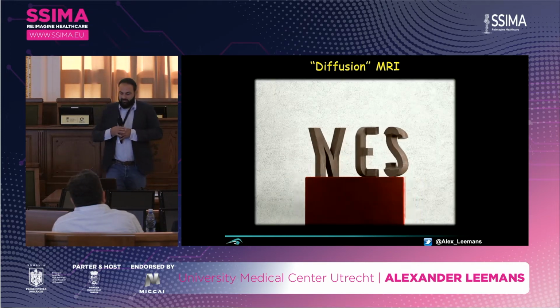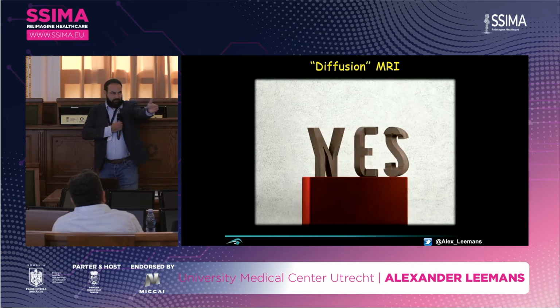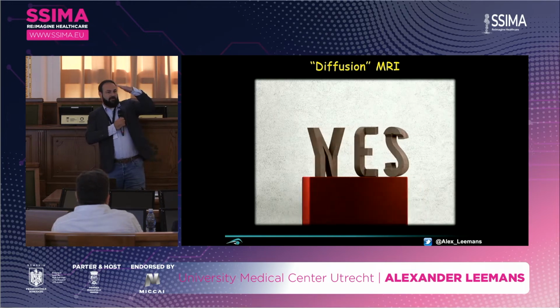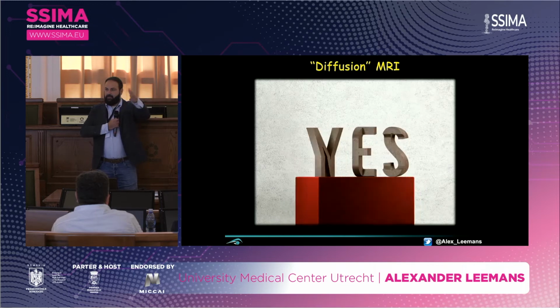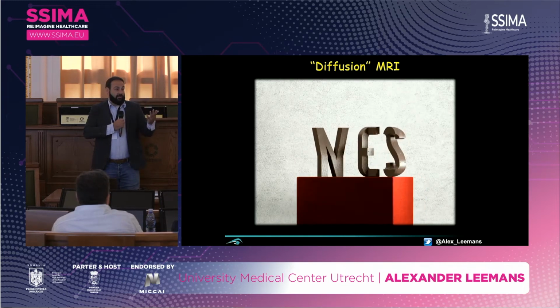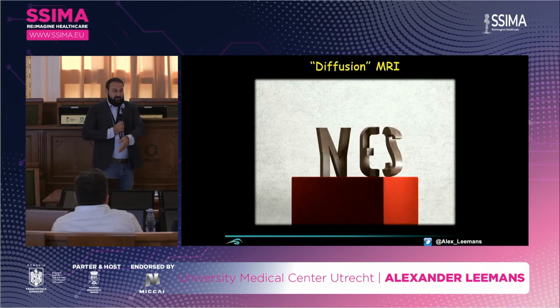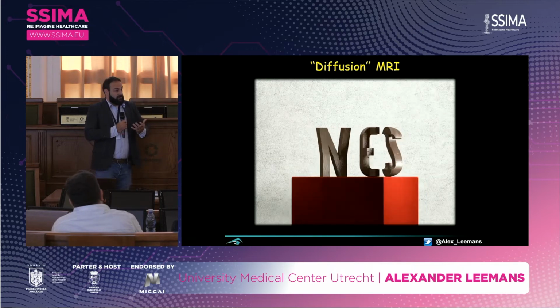And so it's kind of like this, right? So you look at this orientation, you see that, yes, there's diffusion. And then you rotate it, no diffusion in that orientation, right? And so you probe everything, and by doing the full characterization in 3D, you get an idea of the object, right? So in this case, if I were to look at only this direction, I get a yes. If I only look at that direction, it's a no. But you want to have the full description.